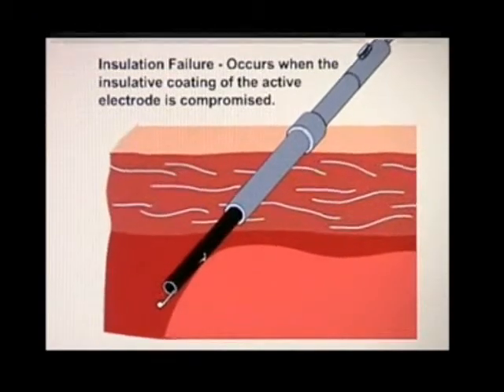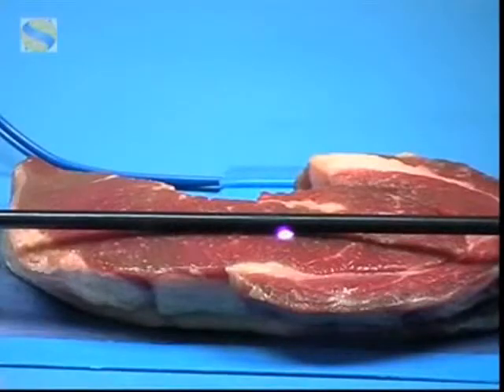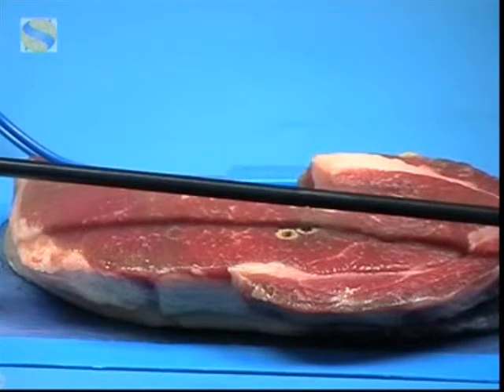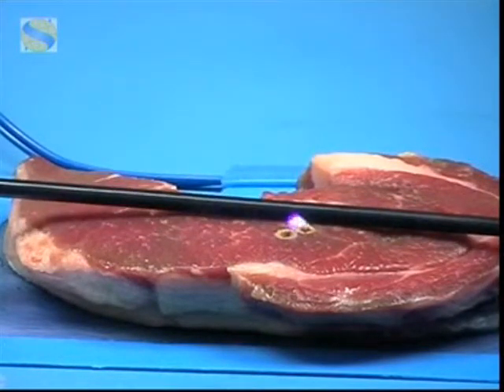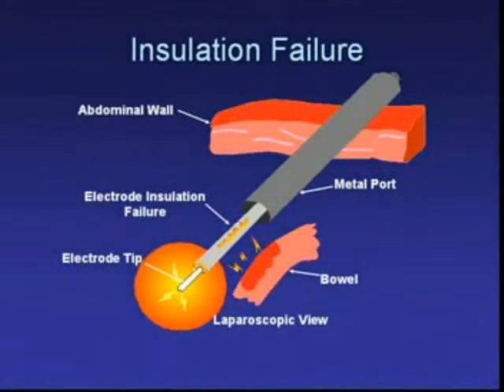Insulation failure. In cases where the outer plastic coating of an electrosurgical hook or similar instrument is damaged, voltage can spark through the compromised insulation. This is especially possible when in coagulation mode, due to the considerably higher voltage. Not only that, this high voltage can also blow holes in weak insulation. Once again, any injuries caused in this way are likely to occur outside the scope's field of view, so you will be unaware of any injury being caused at the time.